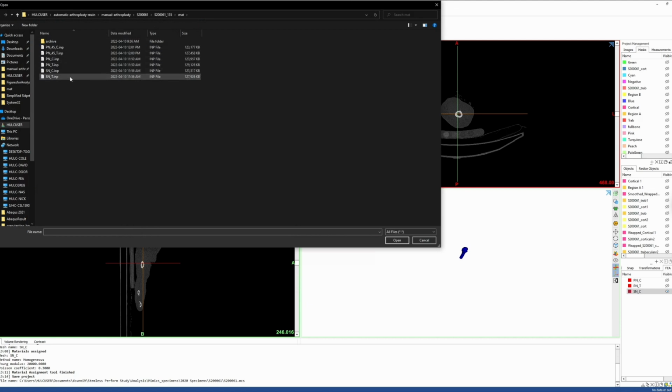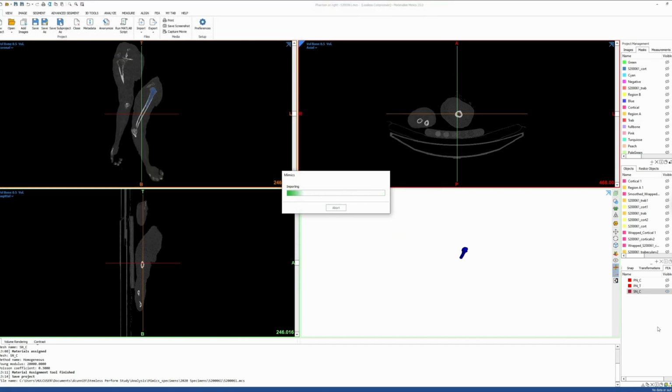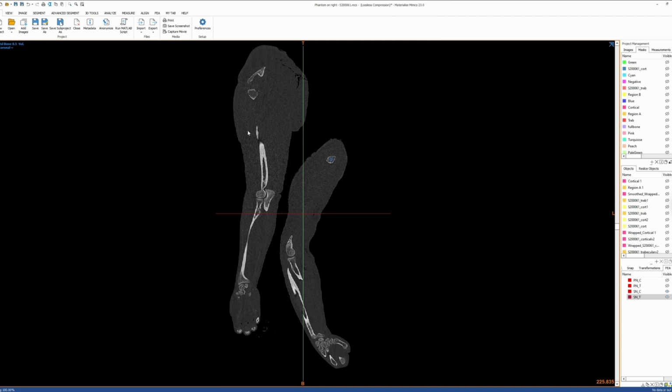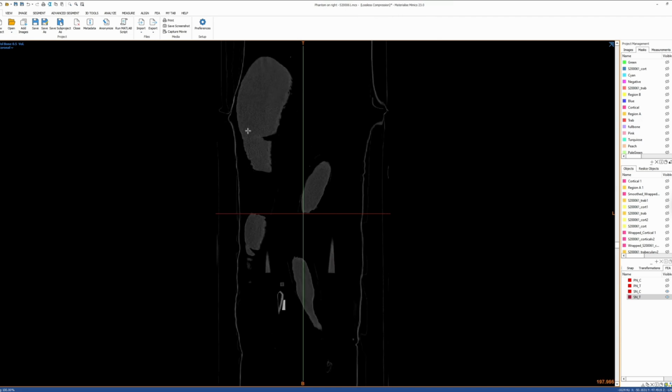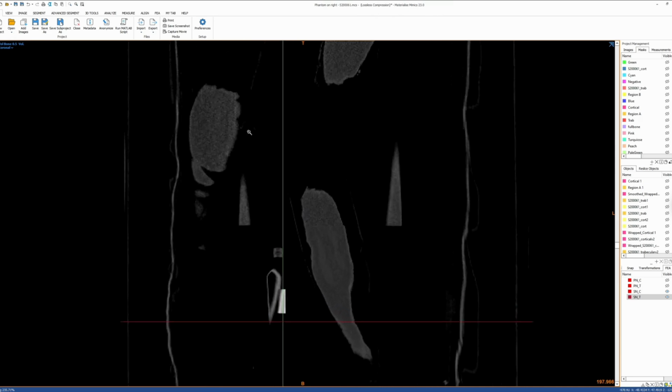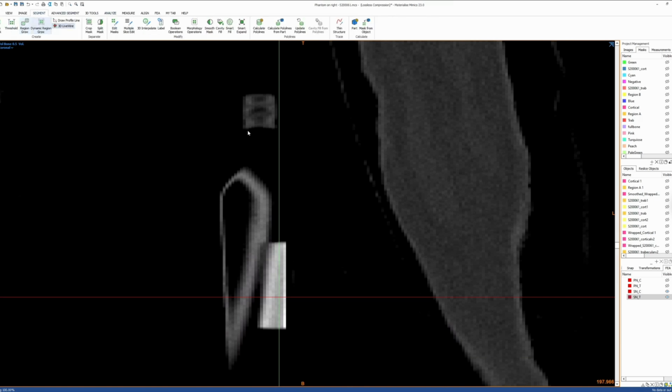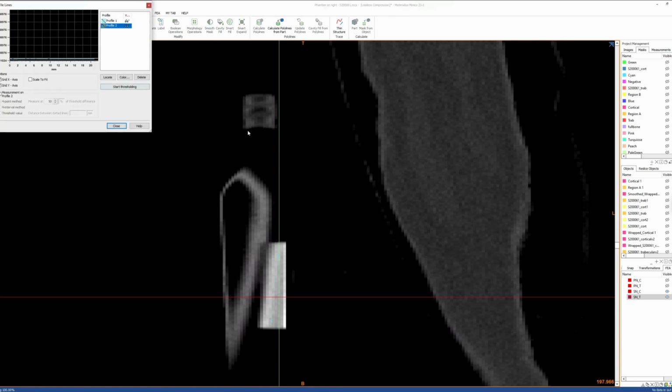After that nice warm-up for material application, we're going to do the more complex trabecular material application process. To get started, import your trabecular mesh and open up the same material property application screen as you did with the cortical. Here, we're going to use our CT phantoms to identify what Hounsfield unit is associated with what calibrated density. For our lab, we use a SB3 cortical bone block and a bottle of water for this purpose.